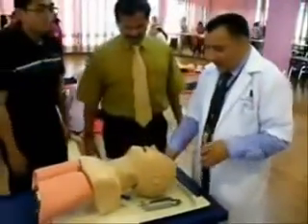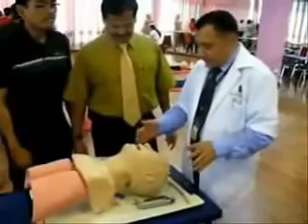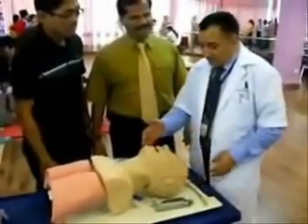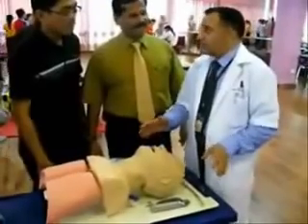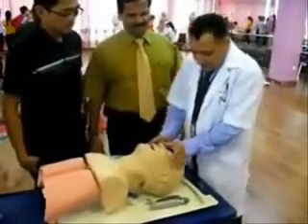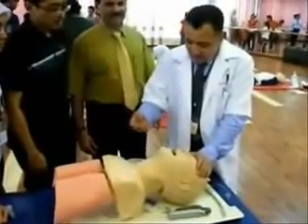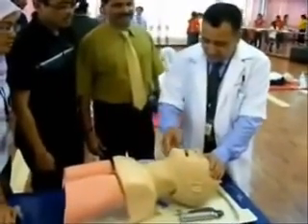While doing endotracheal intubation, you have to put the patient with head tilt and chin lift manually. This is to be done like this — doing the head tilt and chin lift.